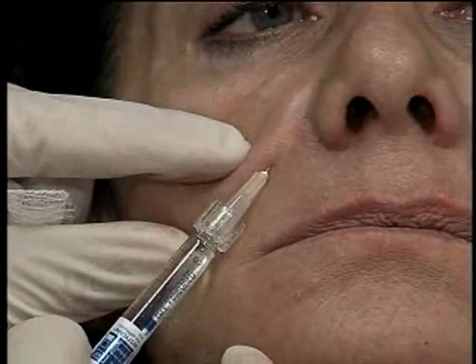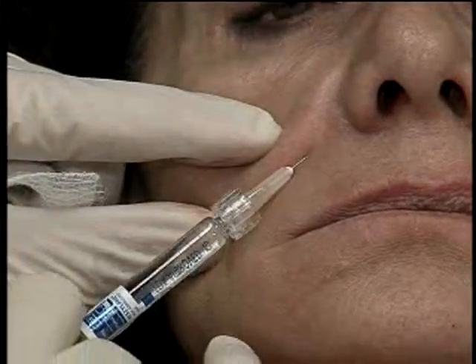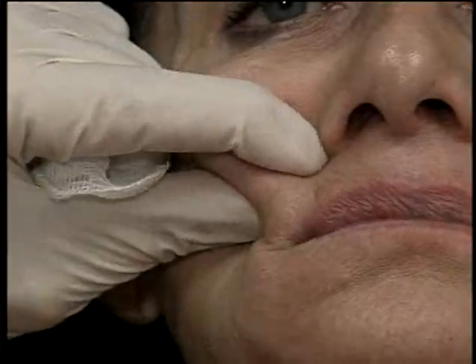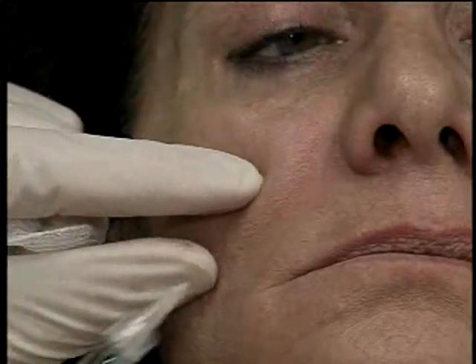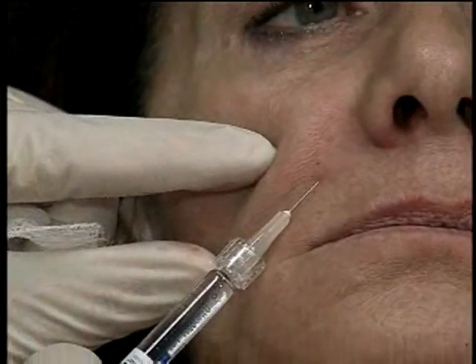Staying just medial to that fold. And you can see it filling up right in front of your eyes. I come here and I massage that a little bit to work it into place. And now I can work my way down here.